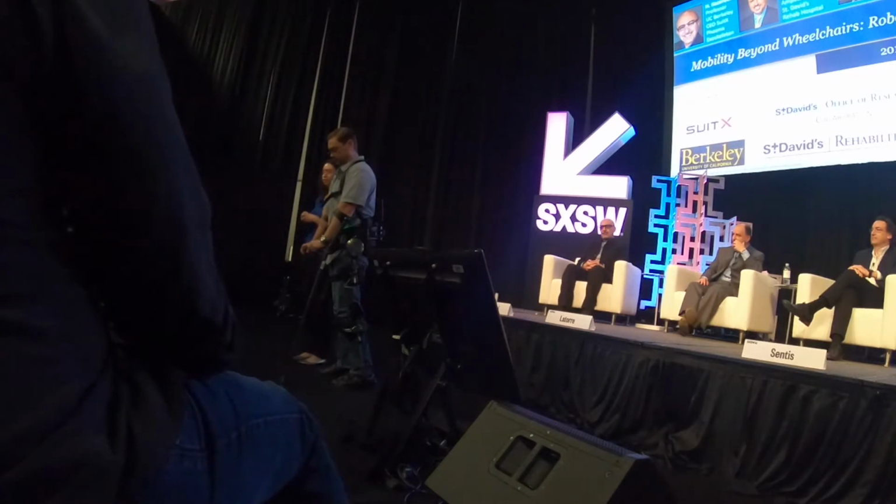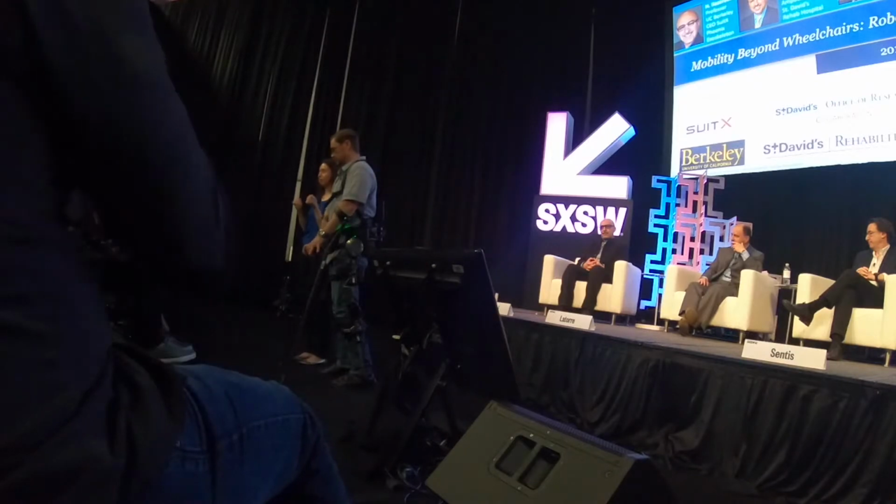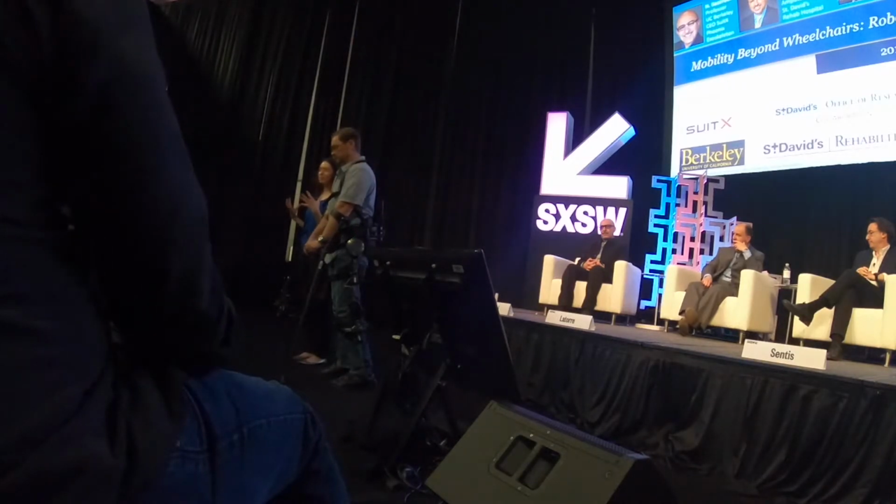The transition for someone who's not able to walk to be able to take a device like this home is to make sure that they're safe and independent and able to walk on their own, so that someone doesn't have to be behind them, grabbing them and holding on to them. So in rehabilitation, the goal is to get someone as independent as possible so that they are doing the work on their own without you having to be there to hold on to them.